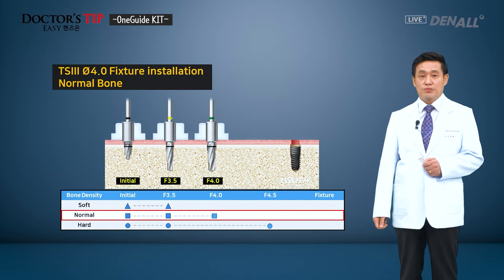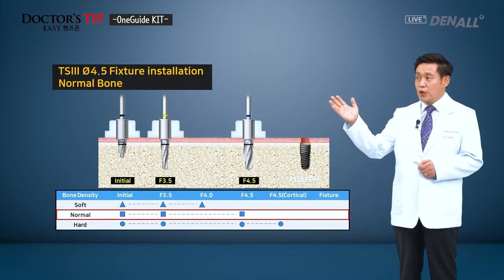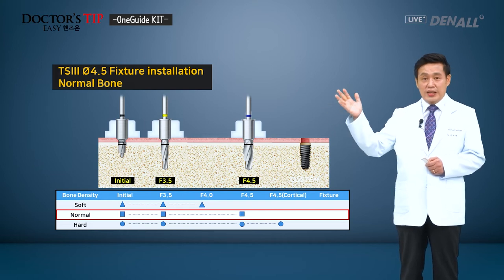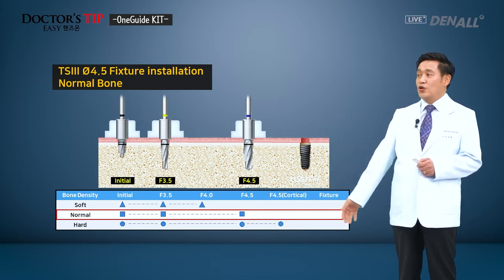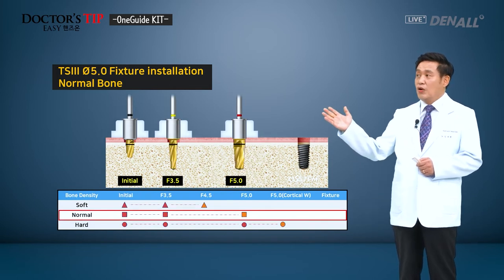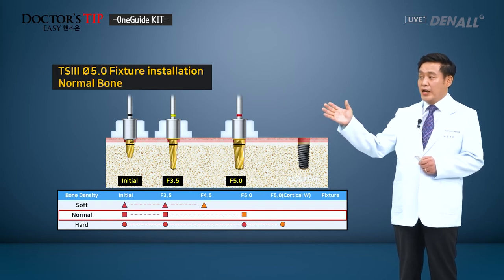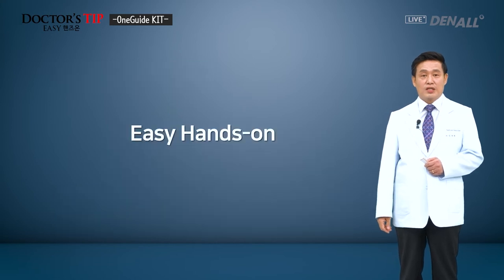And after that, if a TS3 4.5 fixture is placed on normal bone, do initial drilling first, and 3.5 and 4.5 should be used. And if it is hard bone and the initial torque is too much, as mentioned, use the cortical drill. Bearing the same concept in mind, if we place a 5.0 diameter fixture on normal bone, regarding wide barrel, do initial drilling, then 3.5 and 5.0, and then you can place the implant.